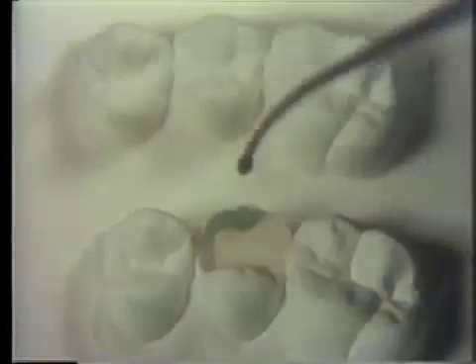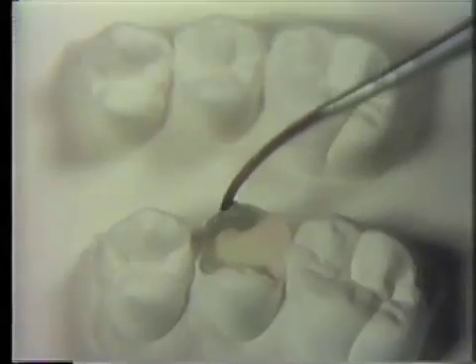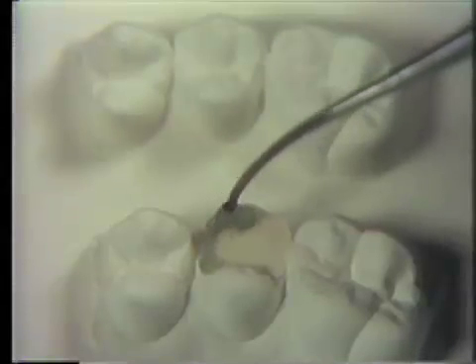Draw out wax into the marginal ridges, first mesially, copying the contour from the natural cusp tip to the interproximal area. Several increments of wax need to be drawn out in layers and laid in a systematic manner. As the wax is laid down, visualize the bulk of wax needed to rebuild the occlusal surface. Note the wax can be worked to build a certain area.